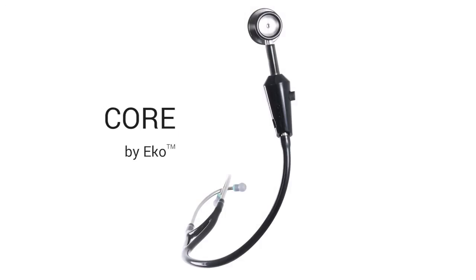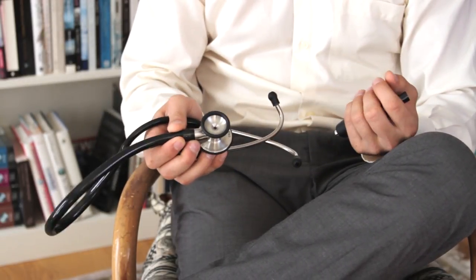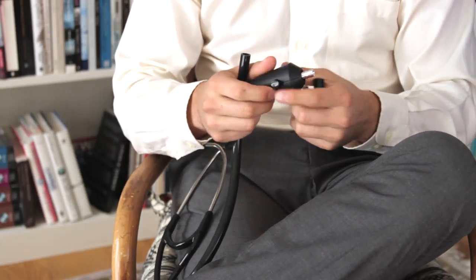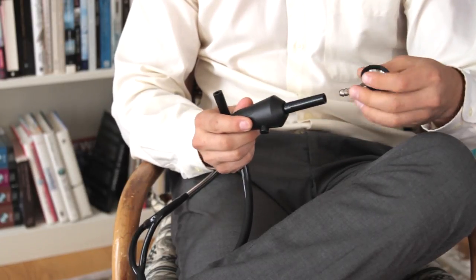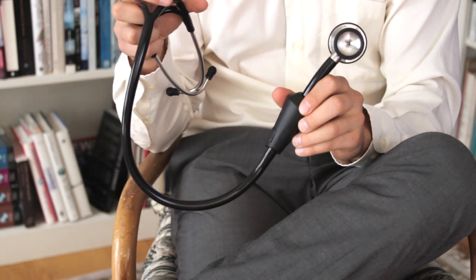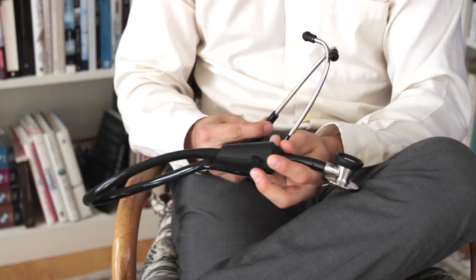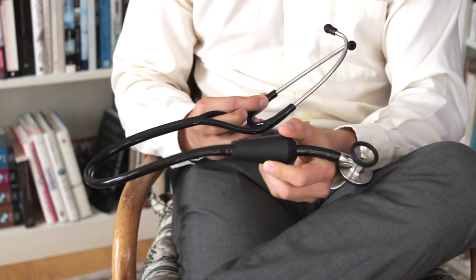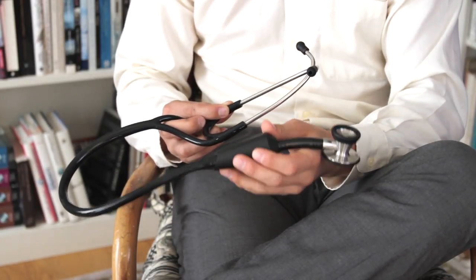Sure. So the stethoscope itself — this is an example of it right here. This is a standard analog stethoscope, just the one that almost every single clinician in the U.S. has. What you can do is pull the head off of the stethoscope — it takes a little bit of force — and this is the Eko Core. It attaches in line on the analog stethoscope, and we include an adapter. You put that adapter in there, and just like that, the Eko Core is in line on the analog stethoscope.